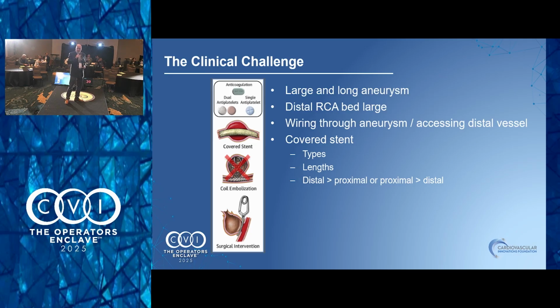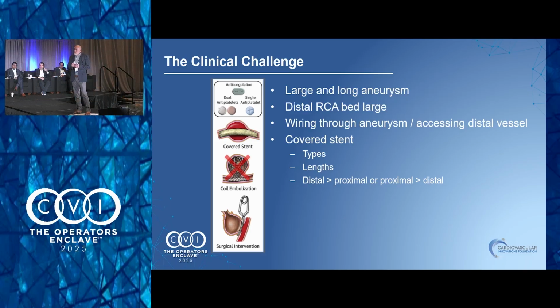How would you do this case? At that point, your IVUS should be showing you the size of the pseudoaneurysm. That's a great point. I don't think that was what was going on, but I didn't save the IVUS for this presentation.